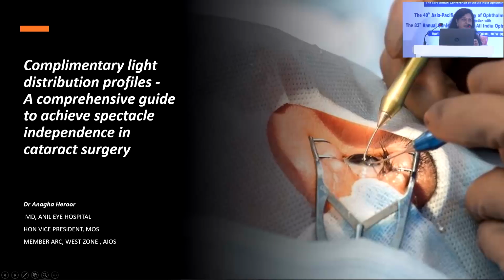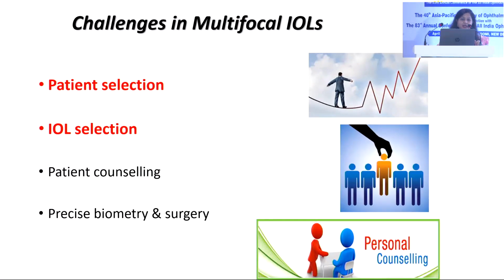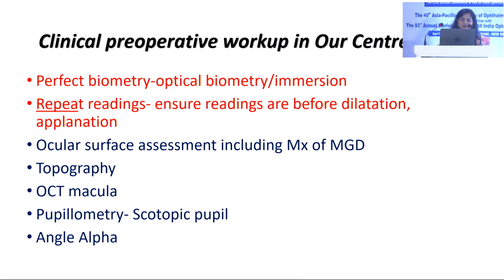So I would be speaking to you on multifocal IOL. All of us in our cataract practice are faced with the dilemma of choosing the best lens for our patient. Whenever we think of multifocal IOLs, we think of spectacle independence and how our patients are going to benefit from the decision that we make in order to give them spectacle independence. For the last 27 years, I've been focusing on advanced technology cataract procedures, especially that on presbyopia management. And I think all of you would agree that the basic challenges in these patients are: one, patient selection; two, IOL selection; third is patient counseling, and precise biometry and surgery.